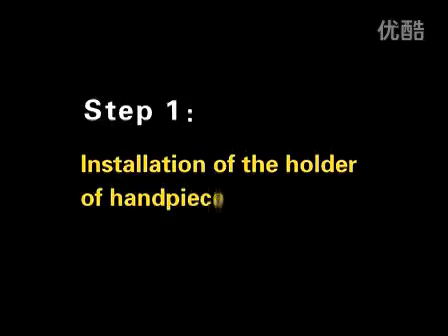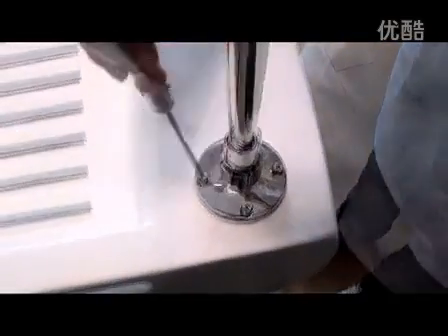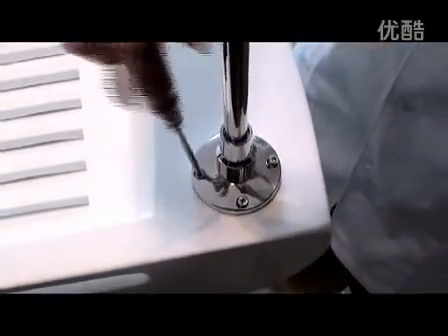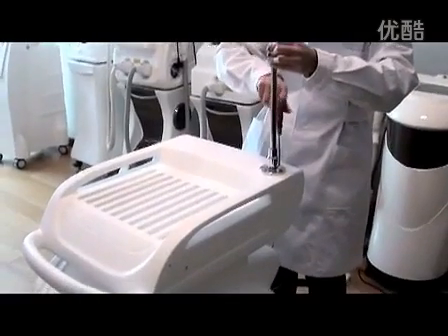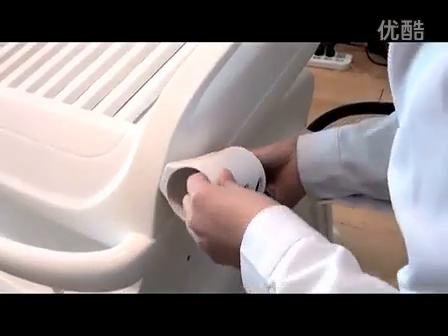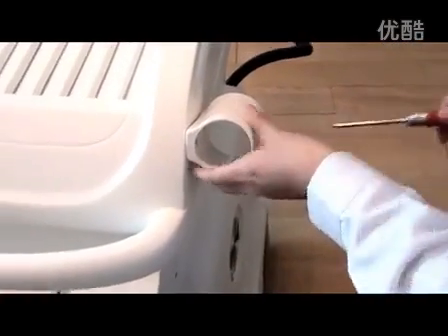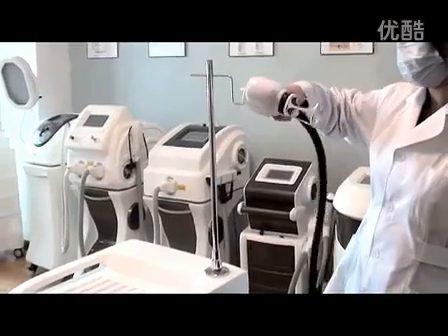Installation. Step 1: Installation of the holder of handpiece. Hang the handpiece in the holder.